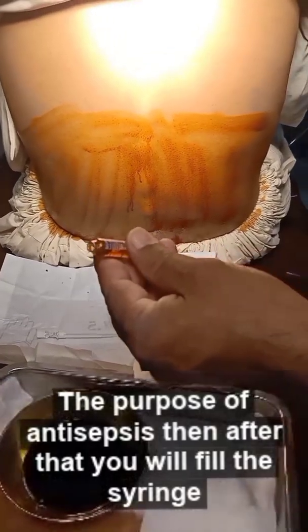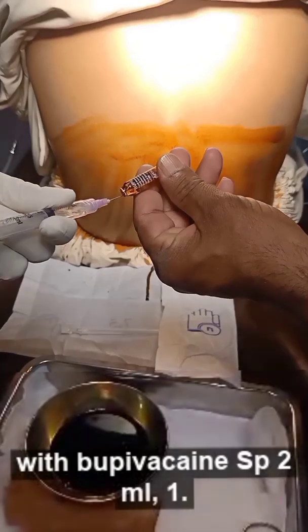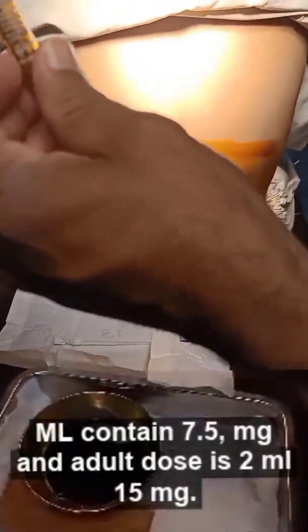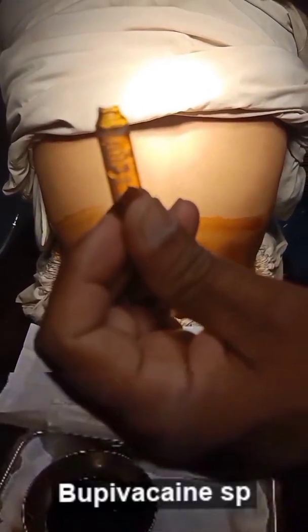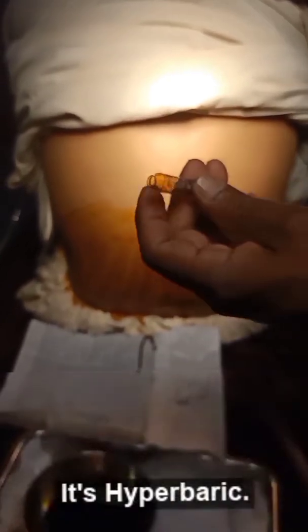Then after that, you will fill the syringe with bupivacaine SP — 2 ml, 1 ml containing 7.5 mg, and the adult dose is 2 ml which is 15 mg. Bupivacaine SP is specifically made for spinal anesthesia and it is hyperbaric.